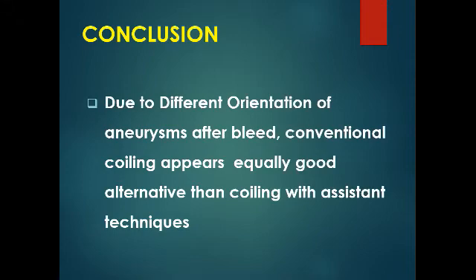So you should start to change your decision plan, and maybe this is the point to start to use another stent-assisted technique or a balloon-assisted technique or even a flow diverter, because you know that sometimes the more devices inside the artery, the more complications you can have.